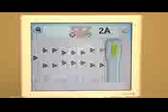The electromagnetic energy is delivered by placing the MiraDry handpiece on the axilla in multiple locations. The specific placement locations are guided by the system software in conjunction with the skin transfer. Prior to placing the handpiece, apply a sheer layer of lubricant to help with tissue acquisition.